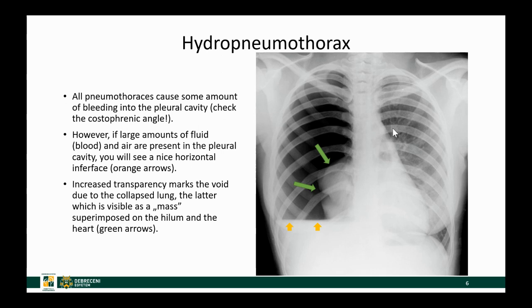Every time there is a pneumothorax there is always a tiny amount of hydrothorax because there is some bleeding into the pleural cavity. If there is more than the usual couple of drops of blood in the pleural cavity, you will see that the air and blood separate from each other nicely by a horizontal layer. The collapsed lung is visible overlapping the right hilar and mediastinal structures. This is what we call a hydropneumothorax.